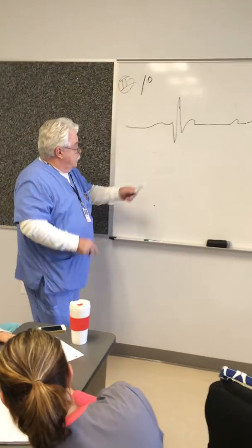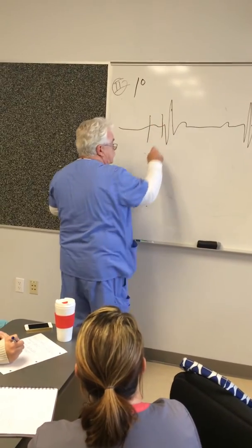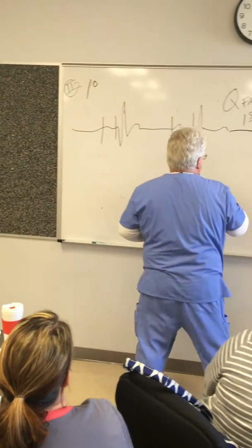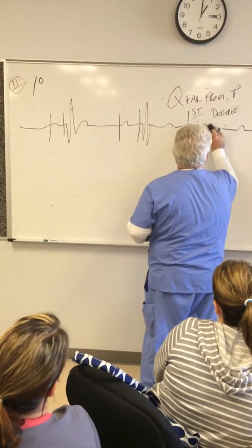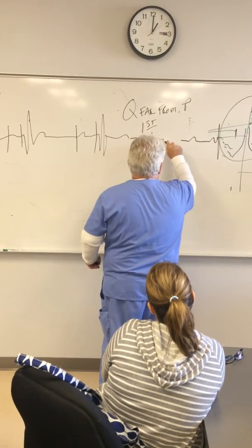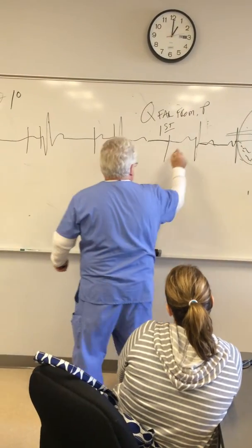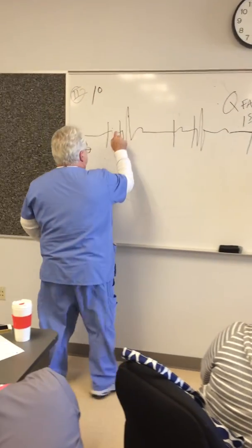Here's a P wave, you have a PRI here. Here's a P wave, you have a PRI. So it's getting bigger.